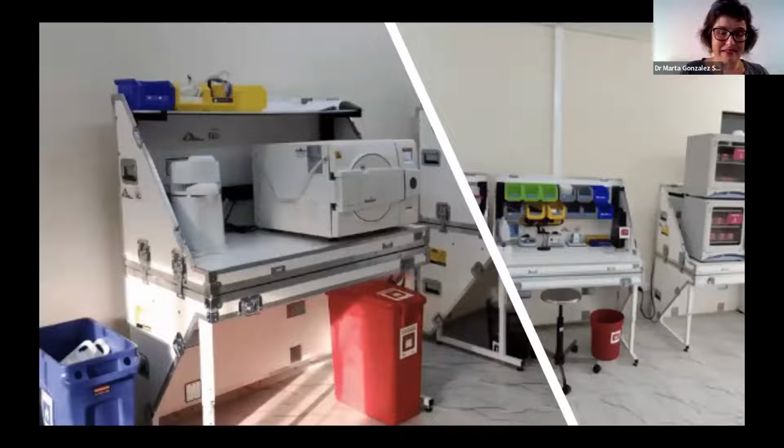And here is how it looks in reality. And this is one that has been set up 2 months ago in South Sudan. So you can really set it up anywhere as long as you have a bit of space. It can go in a tent, it can go in a container, it can go anywhere.